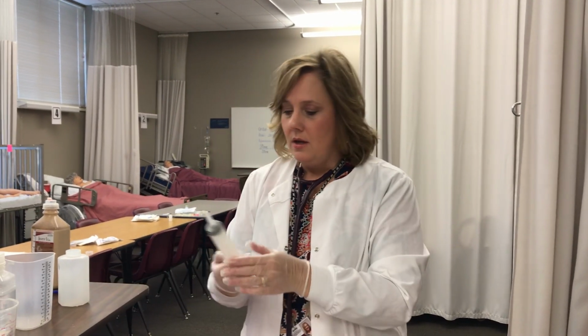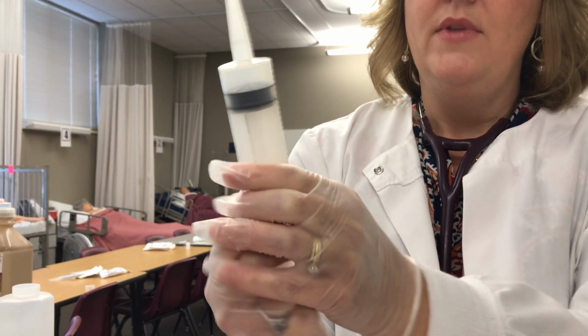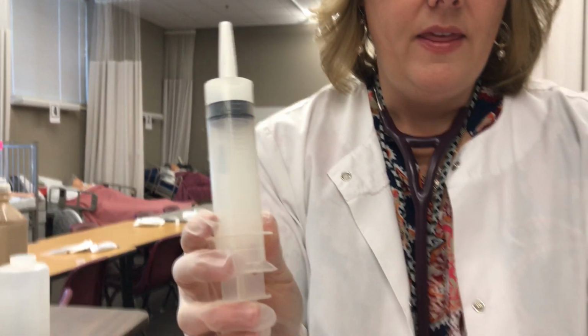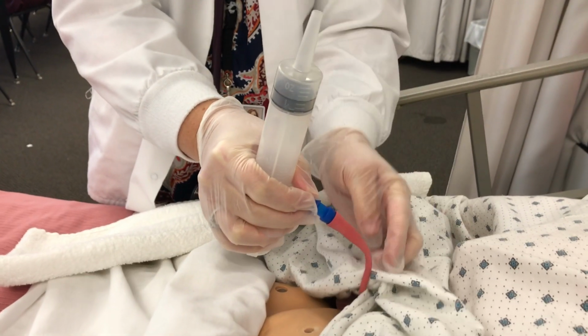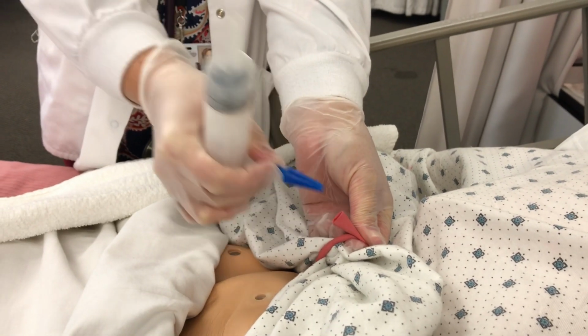So now what I'll do is check for placement. When you check for placement, I'm going to draw up about 10 cc's of air. You can draw up 10 to 30 cc's of air. And then I'm going to attach it to the client's PEG. Now I'm going to clamp this off because I don't want any extra air to come into the site.